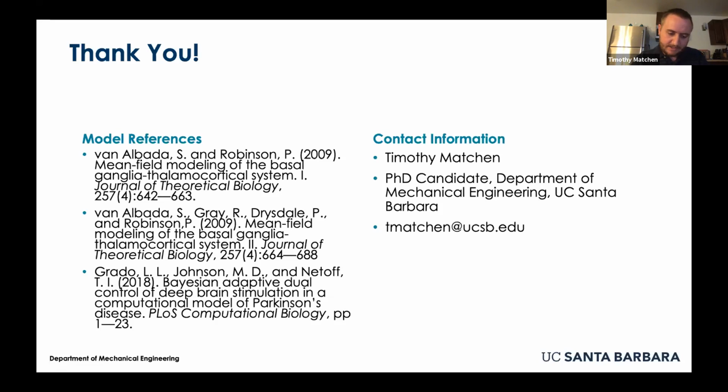So in this feature space, we might know something about it just from doing this autoencoder. In fact, we had done a version of this prior where we weren't using an autoencoder, and we were just going straight from the power spectral density of the LFP. What we found was we had a lot more fluctuations in terms of the performance as we varied the parameters.